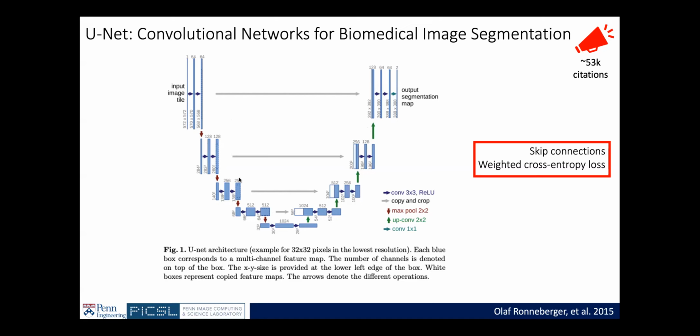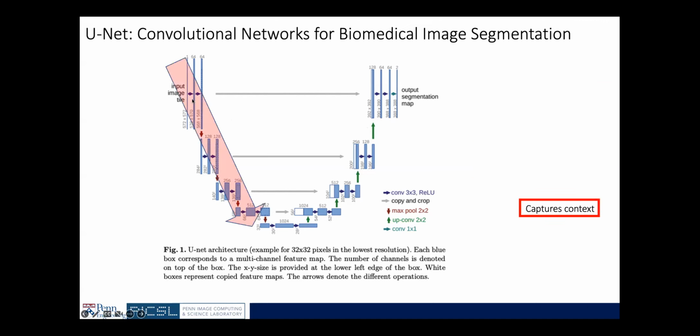So what happens here is you have an input image. Then the first thing you have is a bunch of convolution layers, and max pooling to downsample the image. This leg of the network is called the downsampling network, which basically captures the context within the given input image. The next thing you have is something called latent features, which essentially captures whatever there is in the image into some low dimensional space.